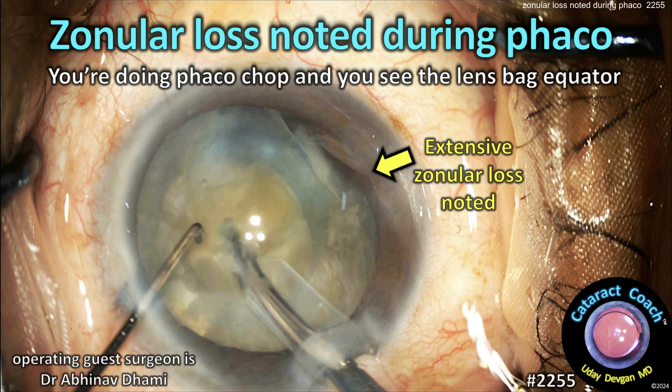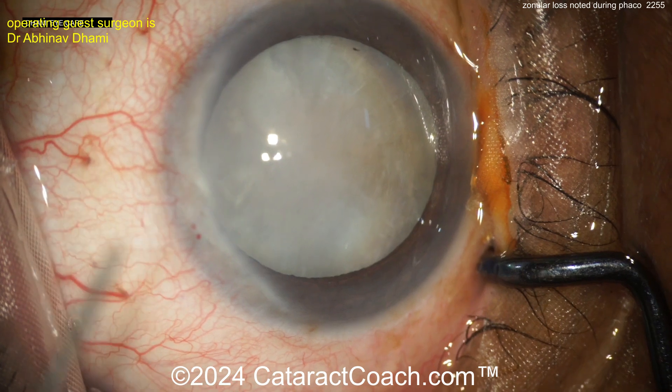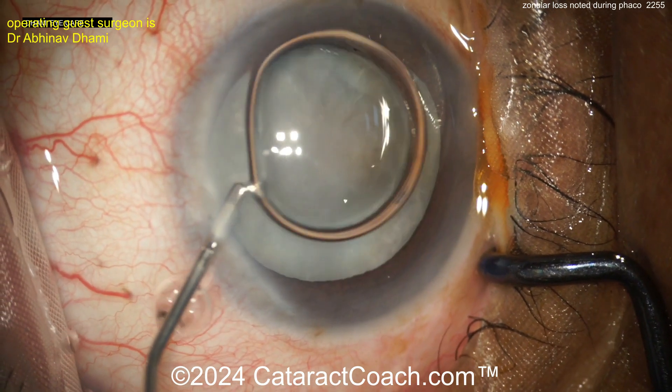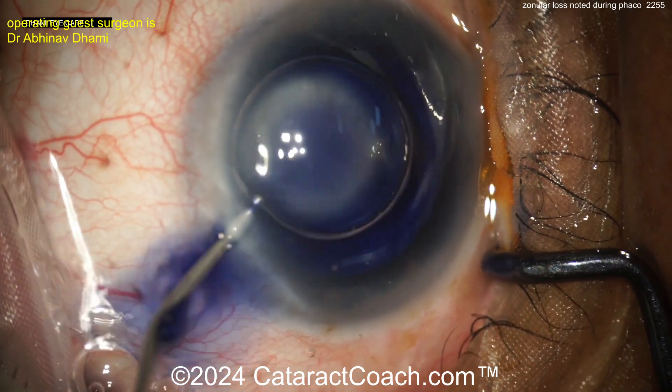CataractCoach.com. Zonular loss noted during FACO. You're doing FACO chop and you see the lens bag equator. Let's watch the case — I'm watching for the first time with you. White cataract and putting in an air bubble and probably a little bit of trypan blue dye.